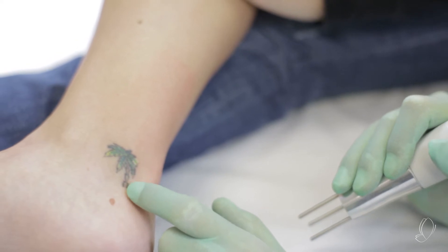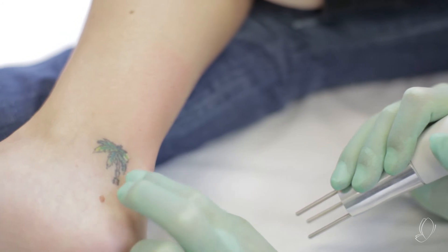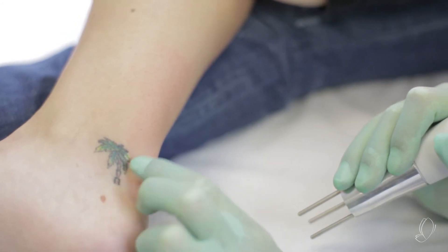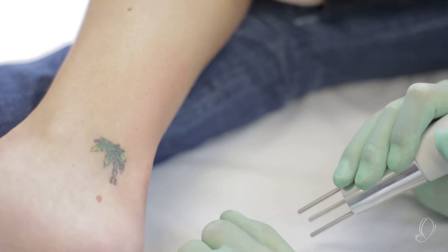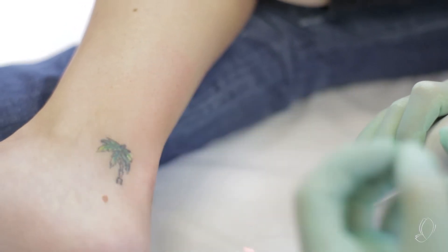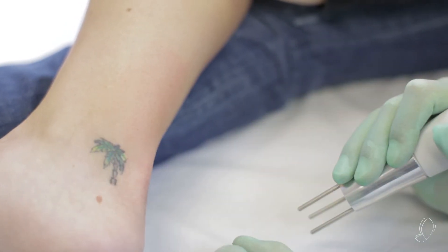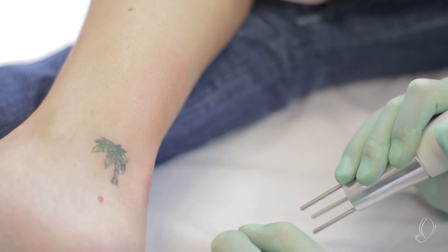Now what we're going to see is there are going to be areas that frost up and get the perfect reaction. And then there's going to be areas in between, like the red ink, the yellow ink and some of the green ink in the palm tree that we probably don't see quite the reaction. But again, this is her first treatment and really what we're looking for is to peel back the layers of the onion, get that black ink out, get down to the purest inks of green, red, yellow, and then next time we'll probably look at using different wavelengths.